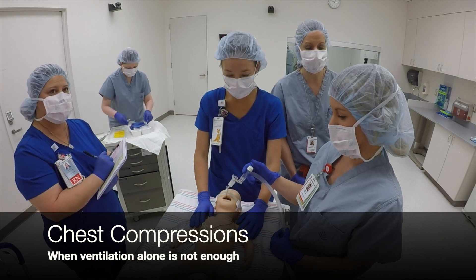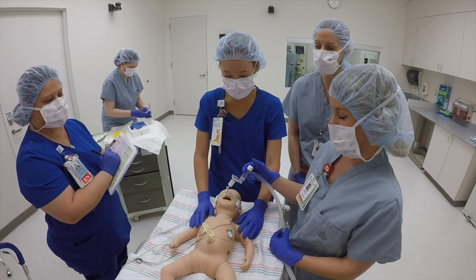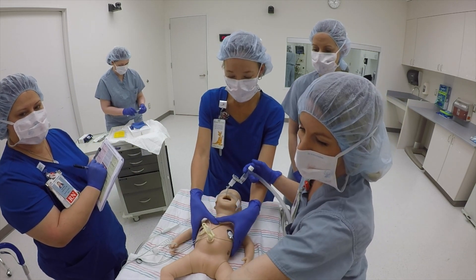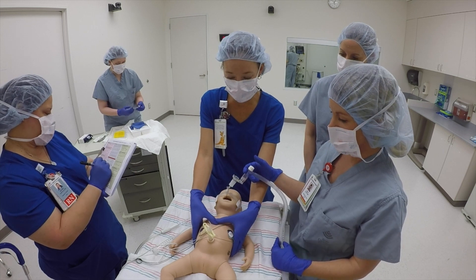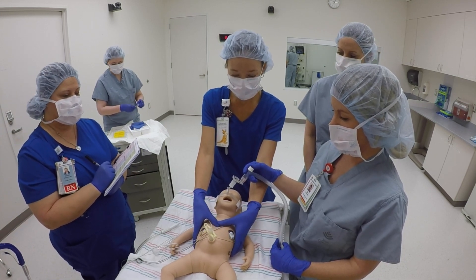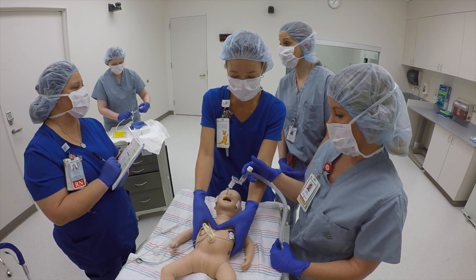Our heart rate is still not above 60 and we are intubated and giving effective ventilation. I think we need to go ahead and start compressions. Going to 100% oxygen. Starting chest compressions at a 3 to 1 ratio. 1 and 2 and 3 and breathe. Can you let me know when it's been 1 minute so we can do a heart rate check?